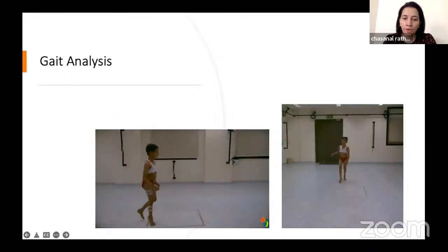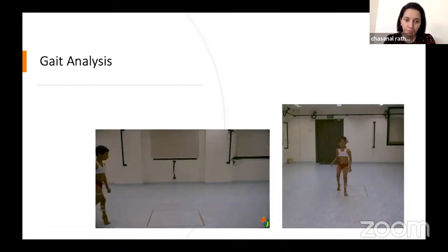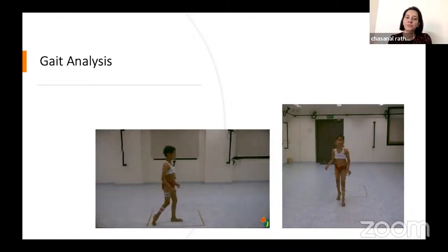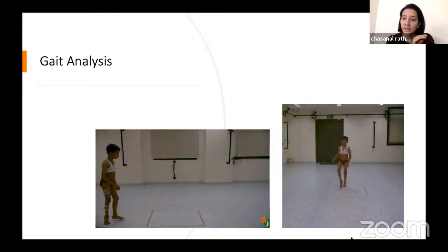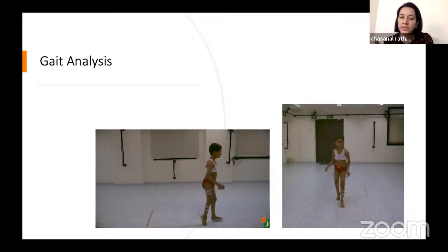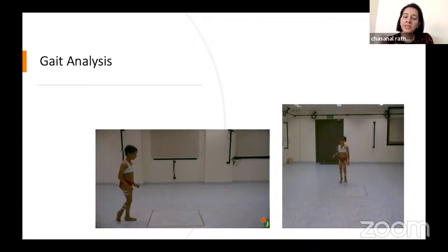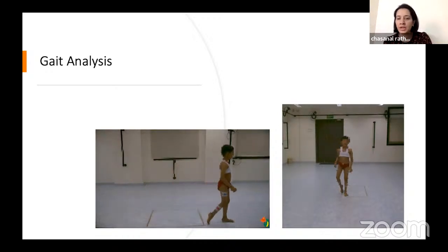Yeah, so what type of clinical gait is it, type 2 or type 3? Is the knee straight at any time? If the knee is flexed throughout, then it becomes a type 3. If the knee is straight to begin with and in mid stance, then it's a type 2. If we can't fit it in there, we don't need to do that. We can just write the child is GMFCS 1, walks with ankle in equinus. The knee is flexed throughout the stance and swing, and the hip seems to be in neutral ROM. Okay, so that's how we just describe it when we see the child walking.